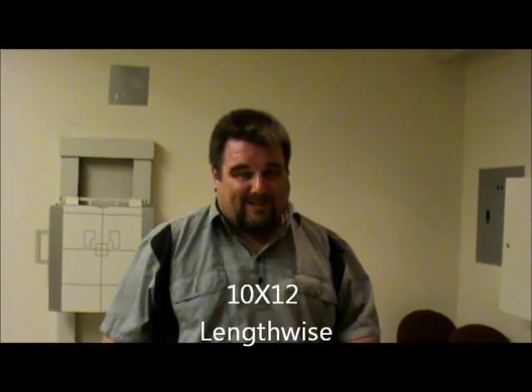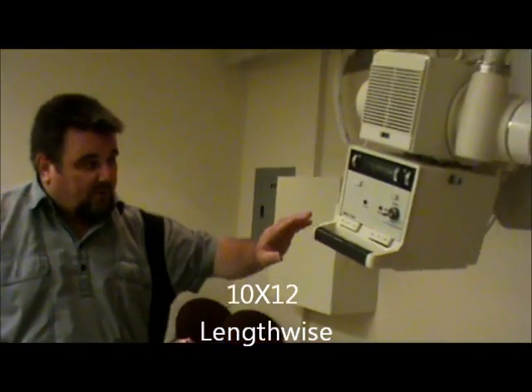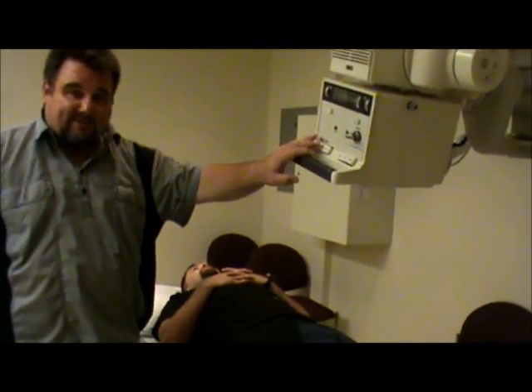The film size for all of these is going to be 10 by 12, and it will be lengthwise. For the sacrum, we're going to start out with the angle of the tube 15 degrees cephalad.